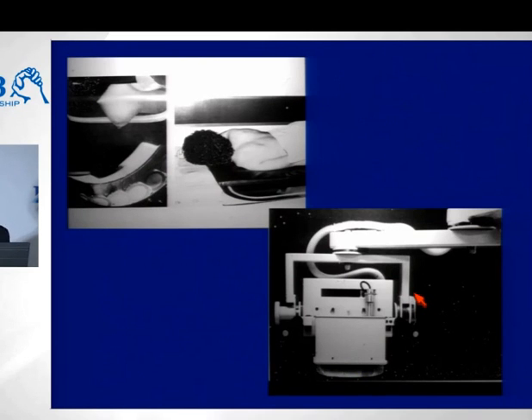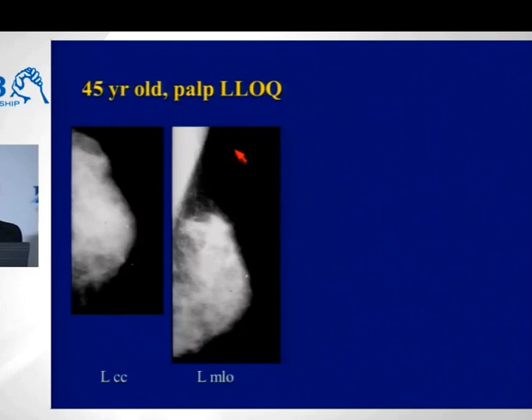Now, in the early 70s, there were attempts made to build an ultrasound machine that would scan a whole breast. And this was a prone table where a woman's breast was suspended in water, and these transducers were below the water scanning her breast, but they were low frequency. This was a supine scanner. The woman would lie on her back, and the transducers are up here, and the water bath was encased by this plastic bag, which would then drape over her breast. And guess what? It didn't work. It didn't work because they had 3.5 and 5 megahertz transducers. The 10 megahertz transducers, which were the first of the really high-frequency transducers, were introduced in the early to mid-80s.